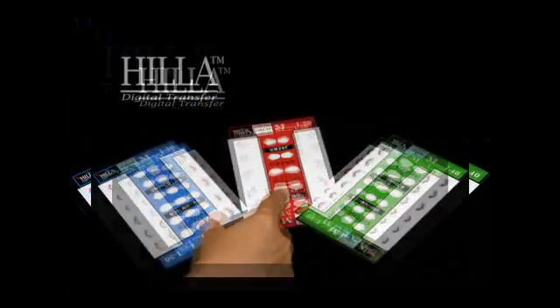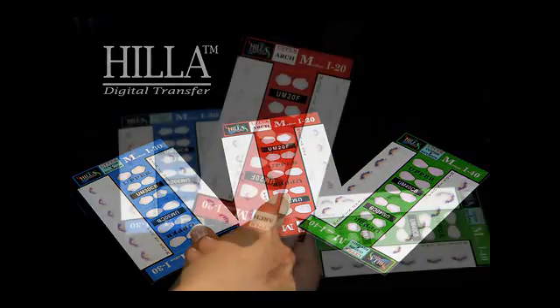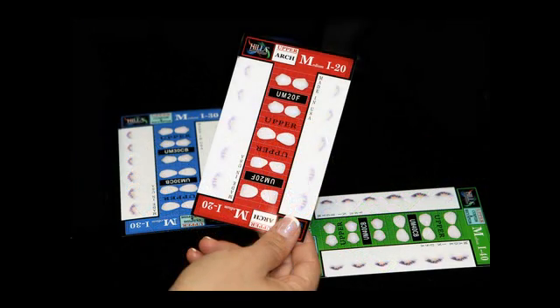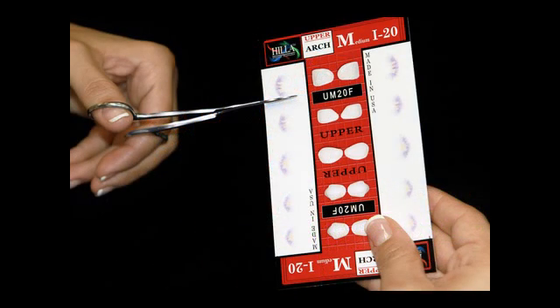Restorations must be glazed prior to the Hilla application. Select the appropriate Hilla transfer based on the intensity desired and the size of the tooth. Cut from the card and gather the appropriate tools.